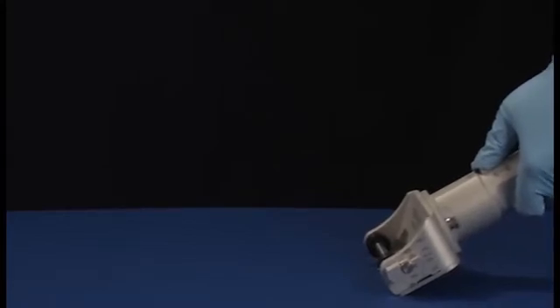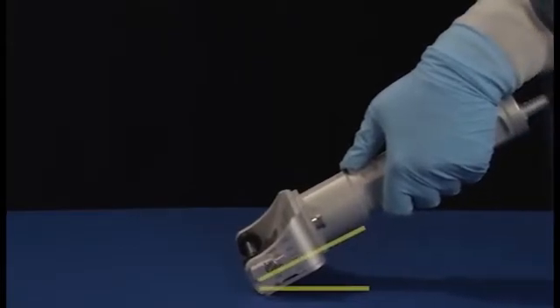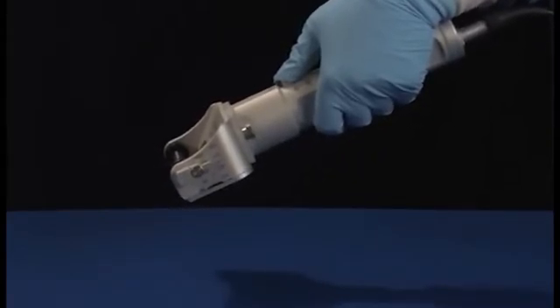Much of the weight of the motor should be carried by the hand that holds the dermatome so as to maintain a reasonably light pressure between the cutting edge and the body of the patient. The instrument should be held at a 25 to 45 degree angle. To sever the graft, lift the dermatome up and away from the donor site.